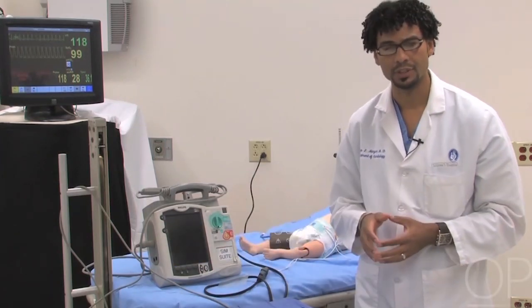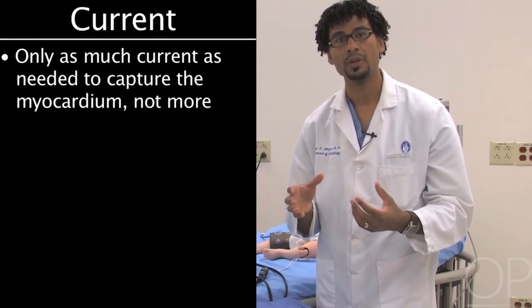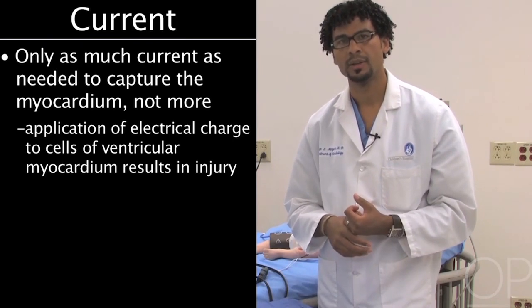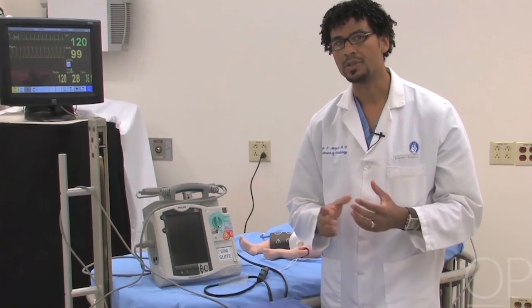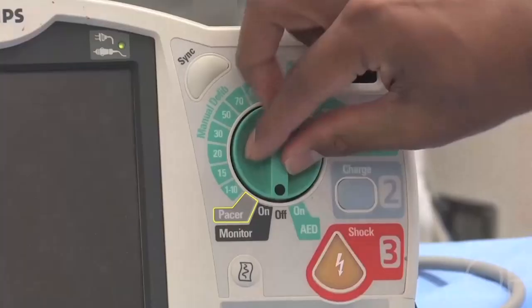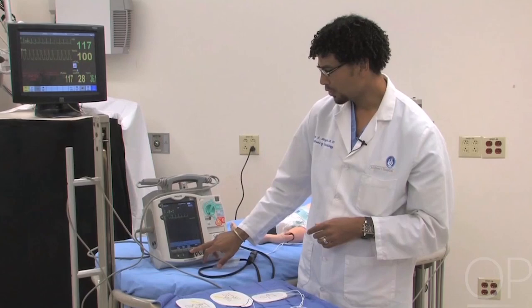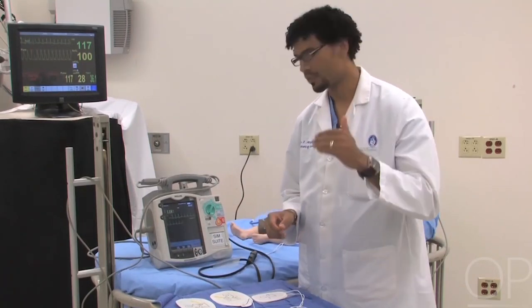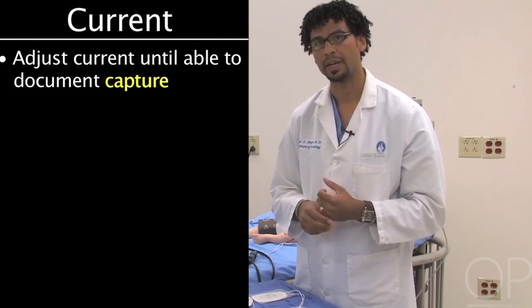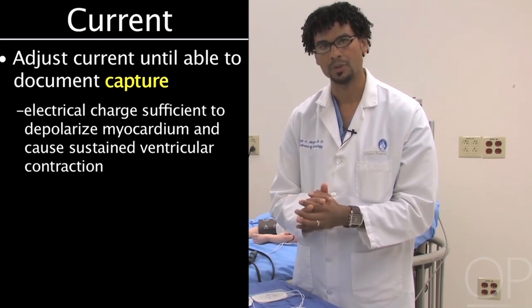When selecting the output current, use as much as is necessary to capture the ventricular myocardium but no more, because application of electrical charge to living myocardial cells ultimately results in ventricular injury. Switch on the machine, select pacing, and choose the output by going up on the current until you can document capture — meaning the delivered charge is sufficient to depolarize enough ventricular myocardium to cause a sustained ventricular contraction.